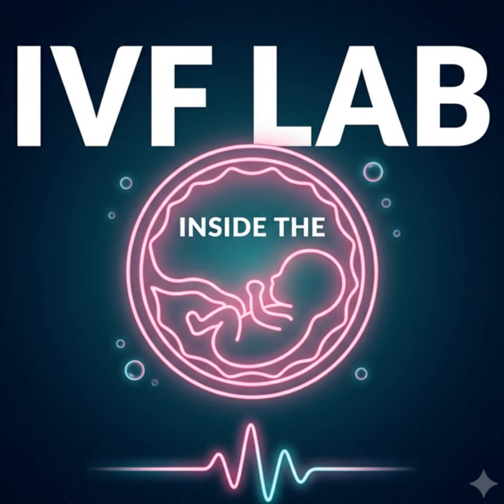It does seem that way, but the decision to use vapor phase storage directly targets the cross-contamination risk we discussed regarding open systems. Oh, the fluid migration thing. Exactly. If thousands of straws are fully submerged together in a shared pool of liquid nitrogen, that shared fluid acts as a potential highway. There is an infinitesimally small but non-zero chance that a microscopic contaminant could migrate through the fluid from one sample to another. Got it. By elevating the assets into the vapor phase, the laboratory completely eliminates the fluid migration pathway. The straws are surrounded entirely by dry, freezing gas.